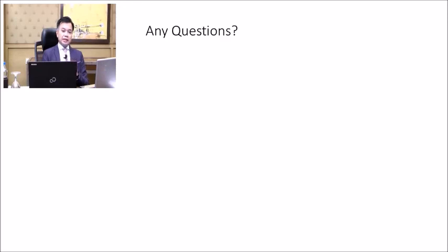So I'd like to summarize the key points here. What we're looking at is trying to move away from just measuring visual performance with our standard measurements of visual acuity, being able to read things at a certain distance, but looking at quality of vision, quality of visual performance, extended range of vision, maintaining of contrast, low levels of dysphotopsia, and patient satisfaction. And that should guide you as to what type of intraocular lens you should use for your premium patients.